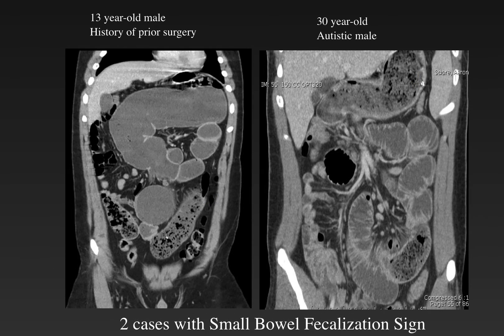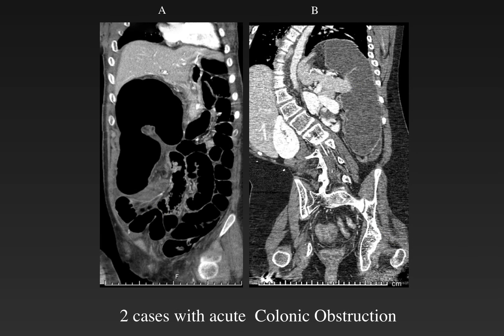Here are two additional cases with the small bowel fecalization sign. The 13-year-old male with prior surgery shows a fecalized distal loop of bowel due to adhesions. However, the 30-year-old autistic patient also has a similar appearance of fecalized distal bowel, but this results from an obstructing trichobezoar in the distal bowel. So fecalization is a sensitive sign, but not specific.